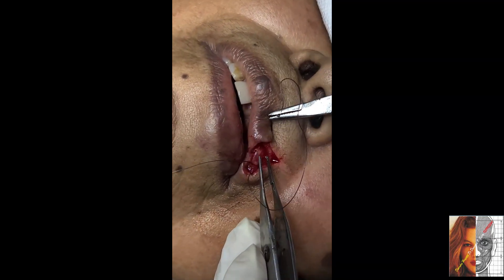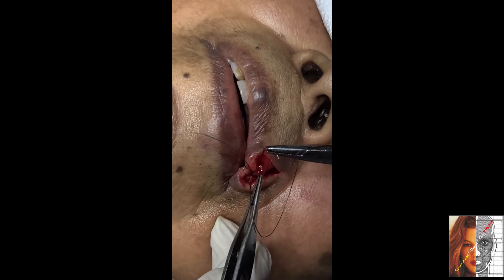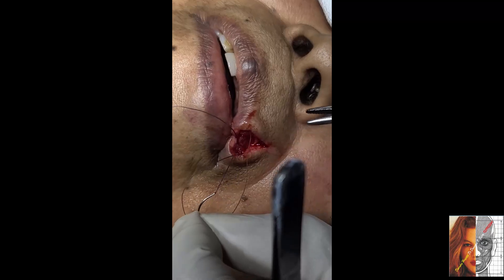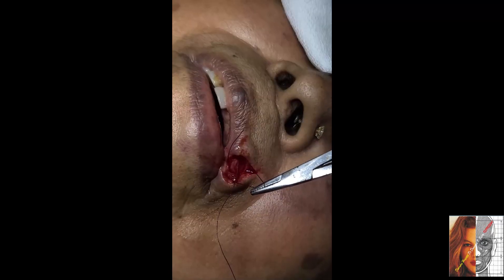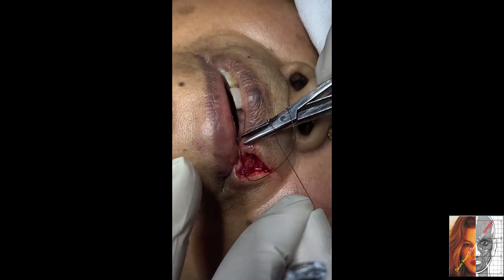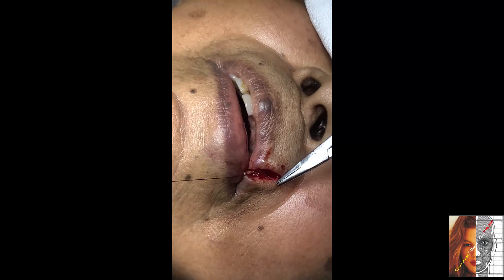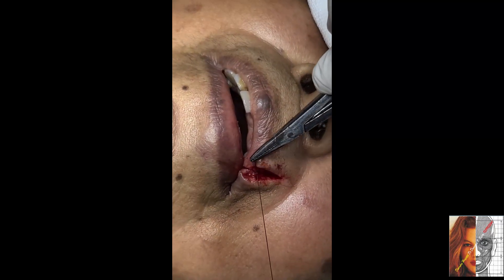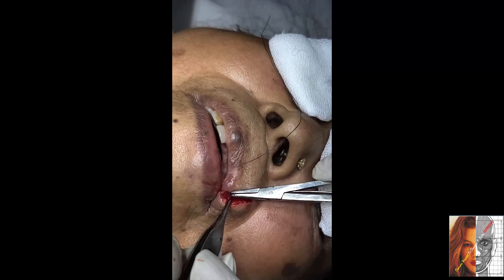Now explore the muscle from this area. So this is from here. Take the bite from the other part of the muscle and now repair it. 4-0 Vicryl for repair of the muscle — the muscle is here.